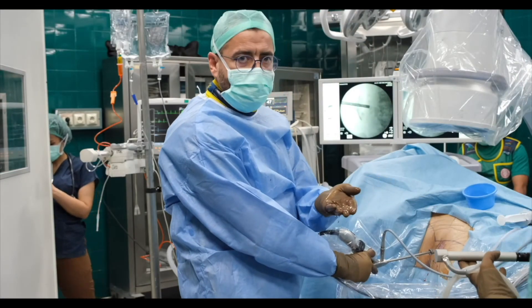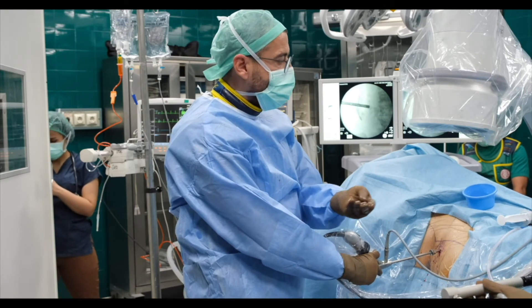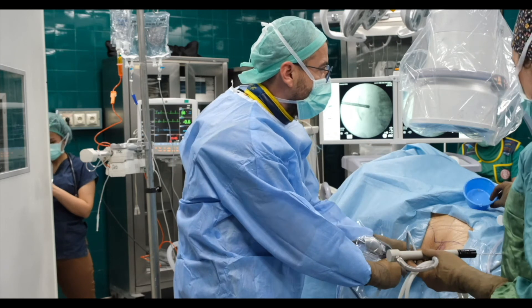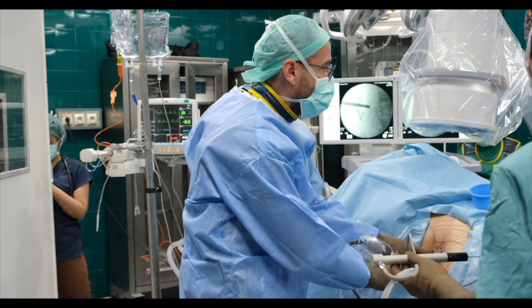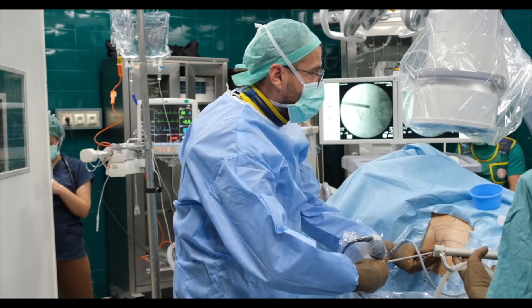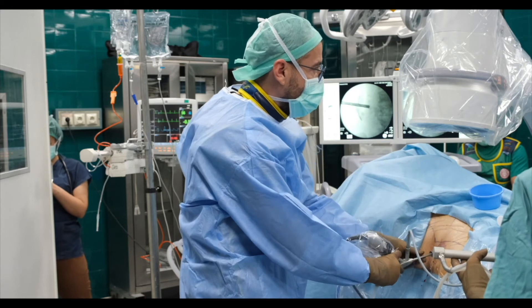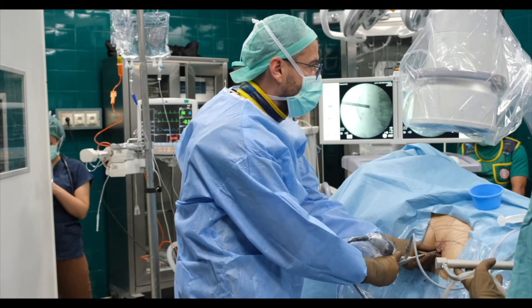Here are some fragments — three to four millimeters in size. We're going to finish in less than 15 minutes; we've already cleared about half of the stone.